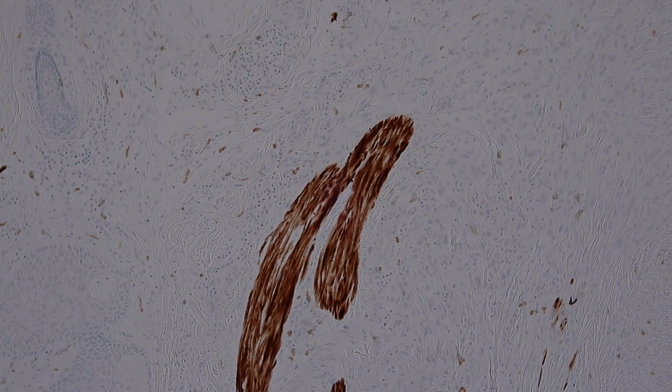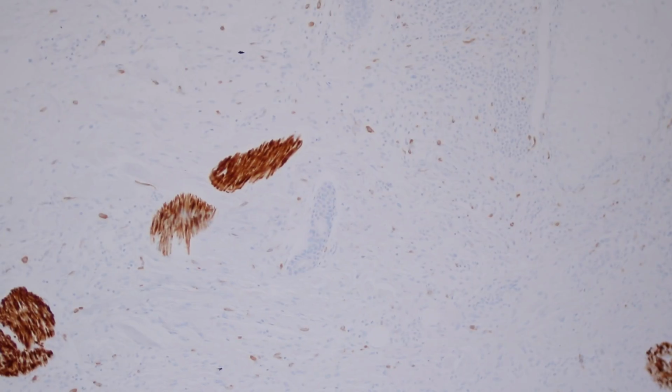Now this stain here is not staining much of anything. You can see that the epidermis is totally negative. All the adnexal structures are negative, but these big bundles of spindle cells here are positive. And these are erector pili muscles, and so this stain is Desmin. Desmin is an intermediate filament that's present in smooth and skeletal muscle, and so you can see it here as a beautiful stain highlighting the erector pili muscles. Okay, and I think down here we can see it in this other section as well. Here's some erector pili, and here.